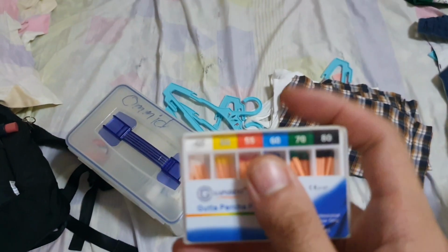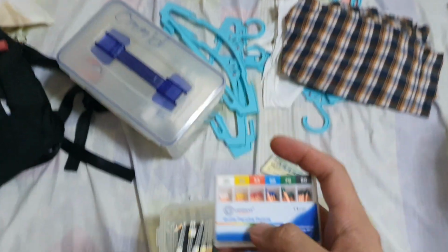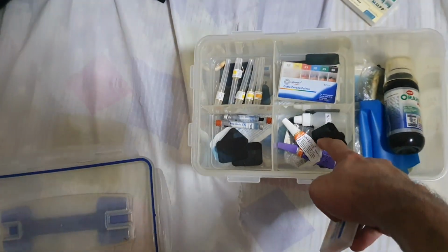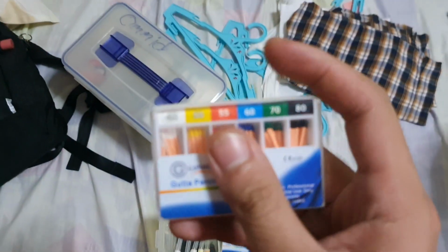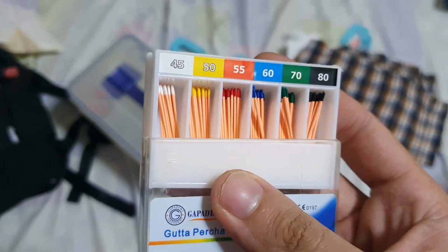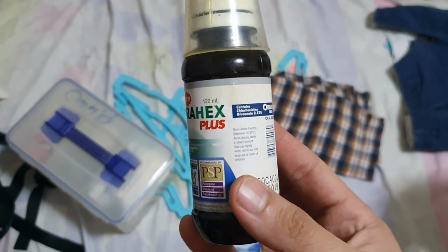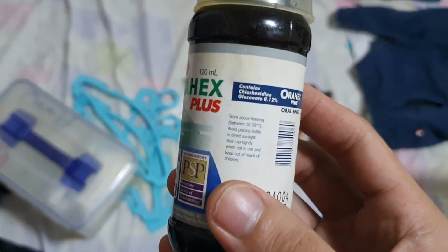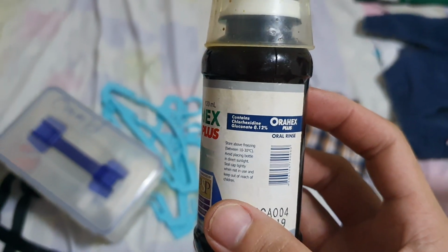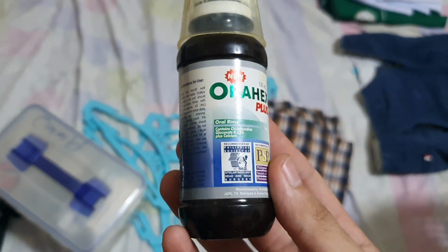And this is the gutta percha that I'm talking about. This is the gutta percha with the AH Plus cement over here. This goes along well with the gutta percha, of course. And this is the Orahex, or the mouthwash that you're going to use. It contains chlorhexidine gluconate, Orahex Plus oral rinse.